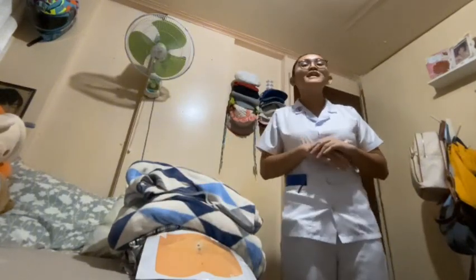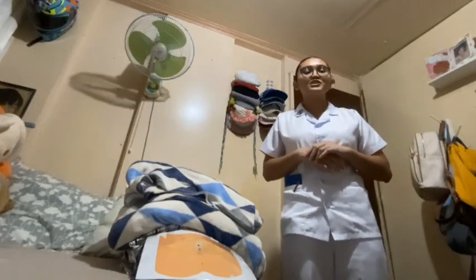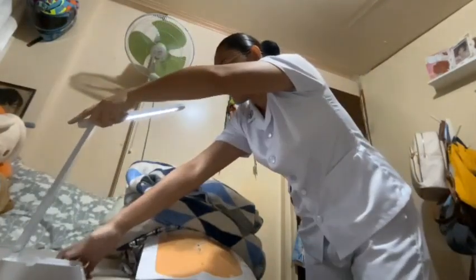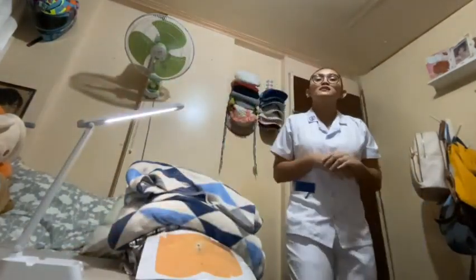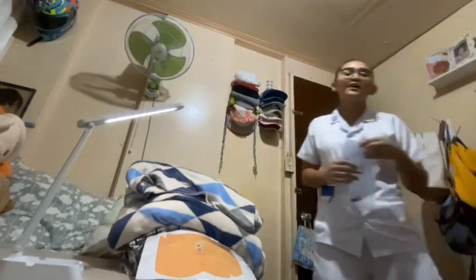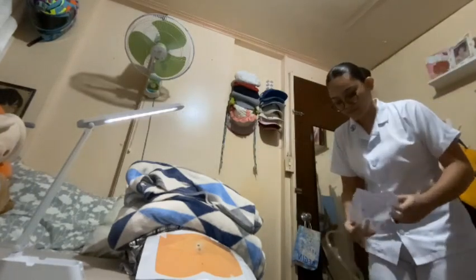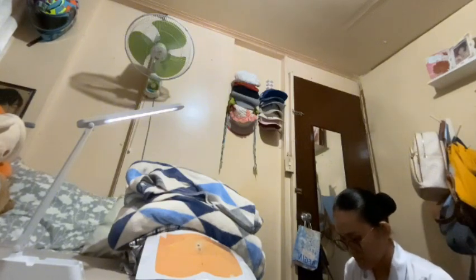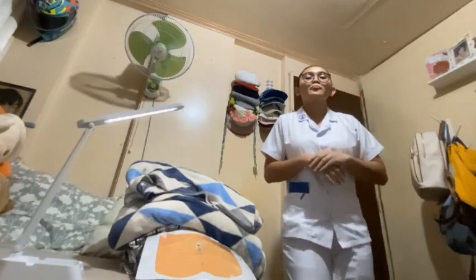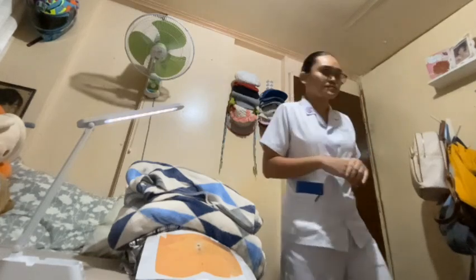Now, to improve visibility, I will apply direct light to the genital area because good illumination ensures accurate visualization of the urinary meatus. Okay, so assuming that this is the direct light source. Then I'm gonna place the urine bag beside the bed frame below the waist level of the patient to prevent backflow of urine. And I will open the tray and arrange equipment accordingly to avoid contamination of the sterile items.